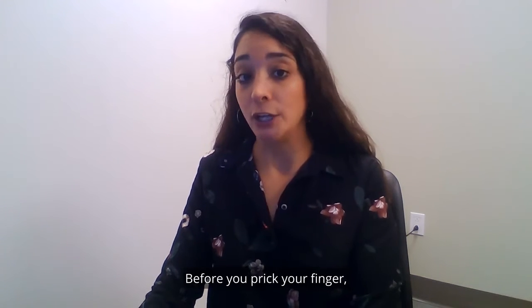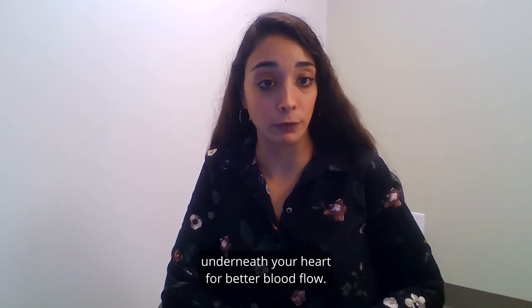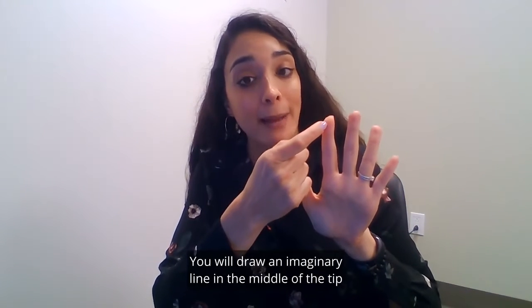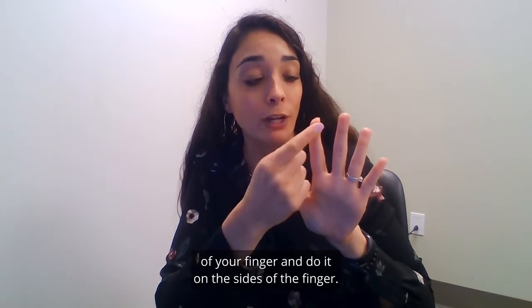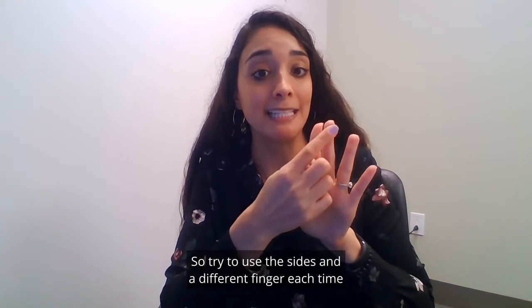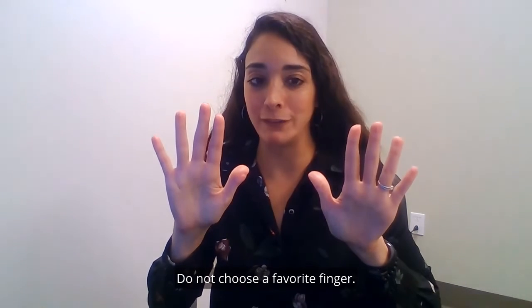Before you prick your finger you can rub your hands like this underneath your heart for better blood flow. You will use the sides of your fingertips to test your blood sugar. Draw an imaginary line in the middle of the tip of your finger and do it on the sides, because we have more nerve endings on the middle part of the finger so it might be painful if we prick there. Try to use the sides and a different finger each time — do not choose a favorite finger.